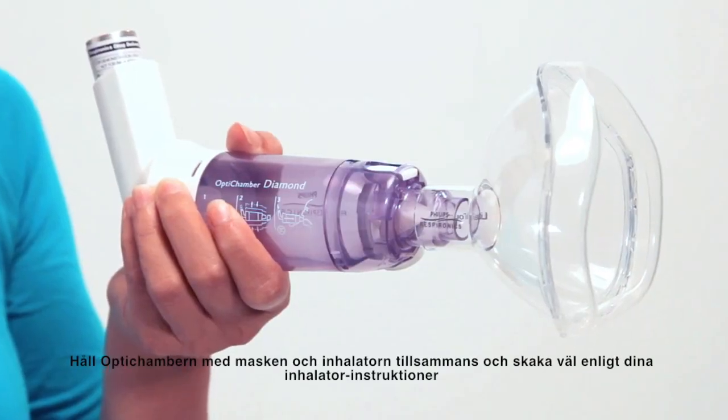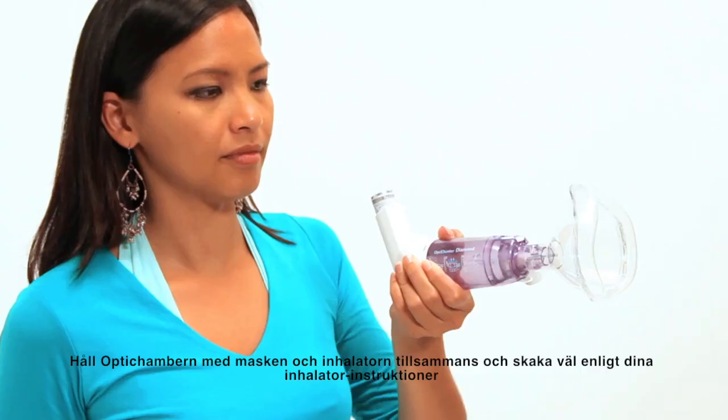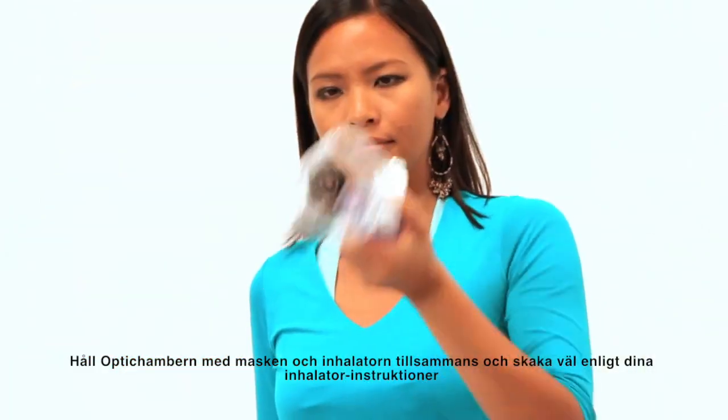Hold the diamond with mask and MDI together and shake well according to your MDI instructions.